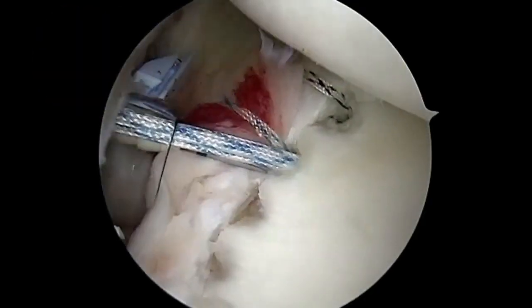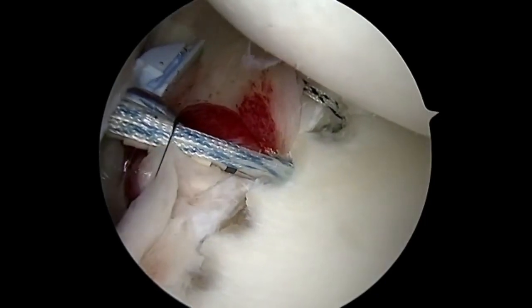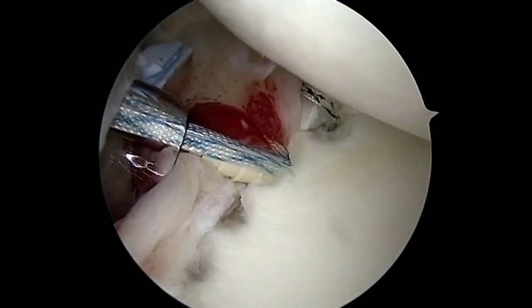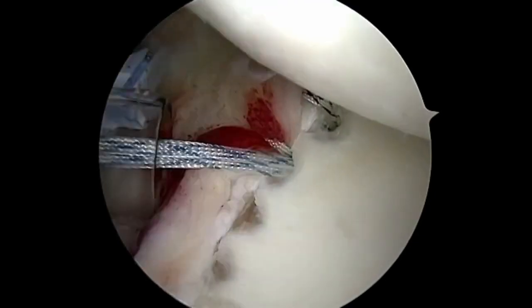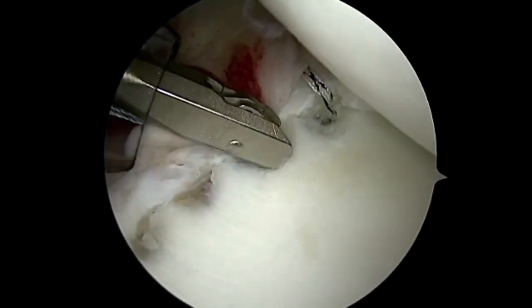I deploy this anchor with two hands. I have an assistant hold the scope. I take out the slack of the suture with one hand. I'm placing tension on the suture. With the other hand, I'm controlling the driver. The assistant mallets the anchor into place. Appropriate tension on the suture is critical as you deploy the anchor to get a good solid labral repair.